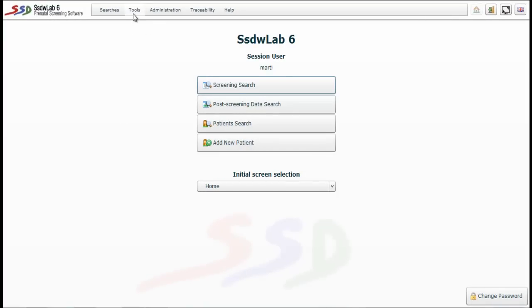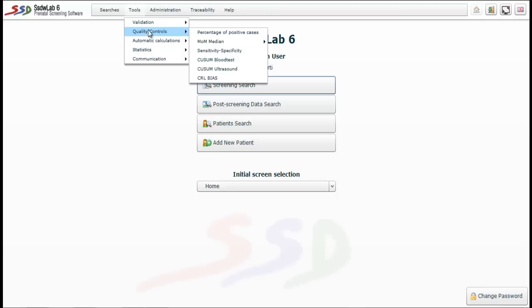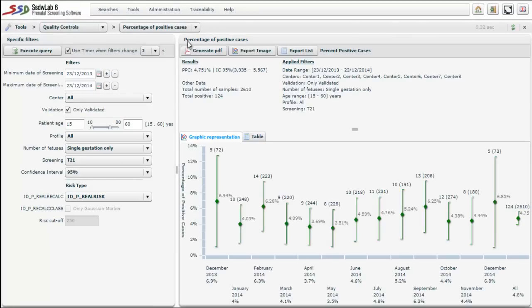We go to the main screen and access the menu called Tools. We choose the submenu Quality Controls, specifically the option percentage of positive cases.